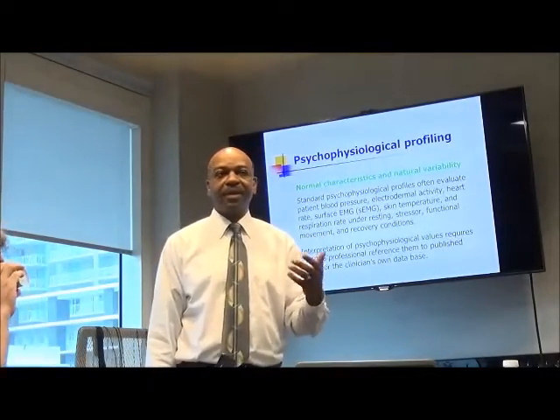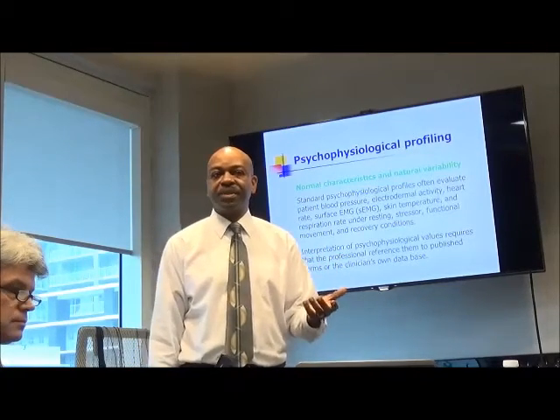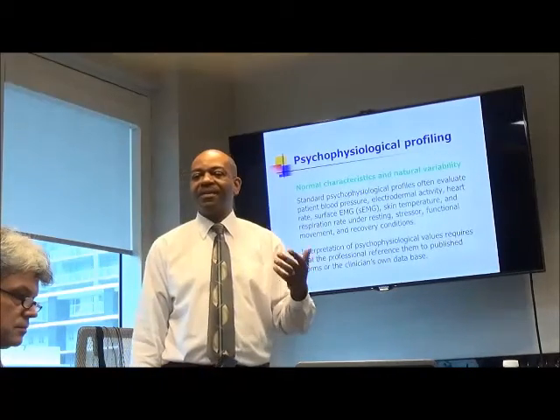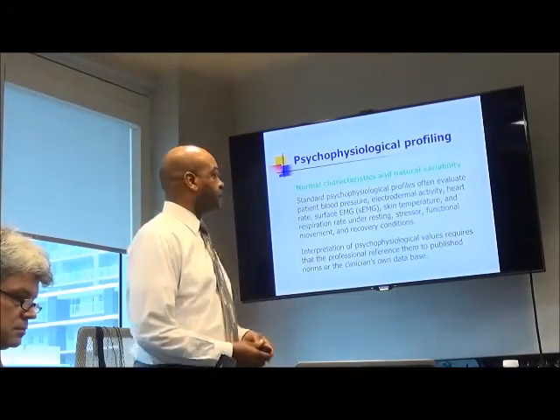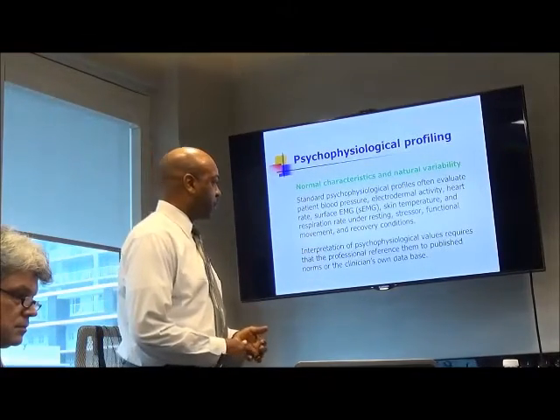That's more of a dynamic assessment, especially for EMG. You might use it for other modalities, but mainly you would be interested in movement with EMG or in different postures. And recovery, which is important.